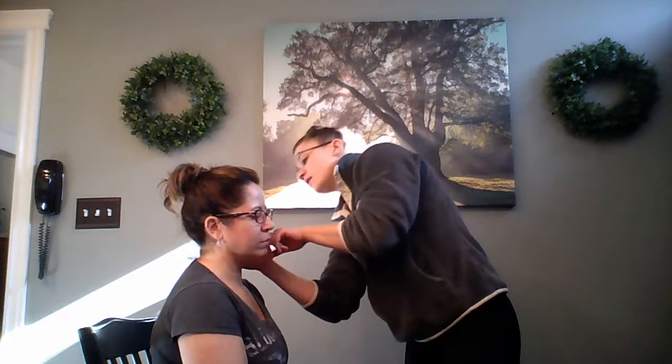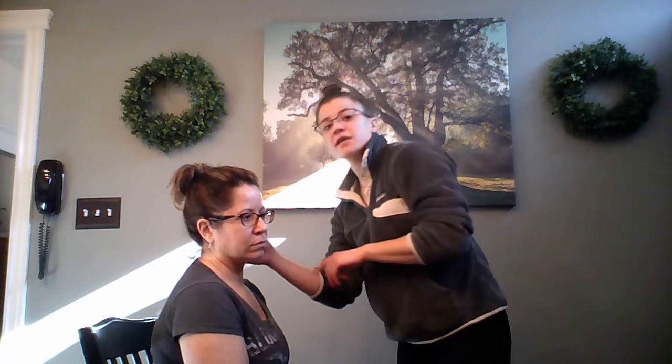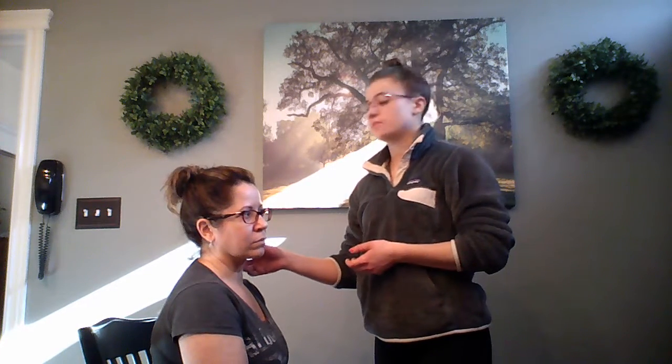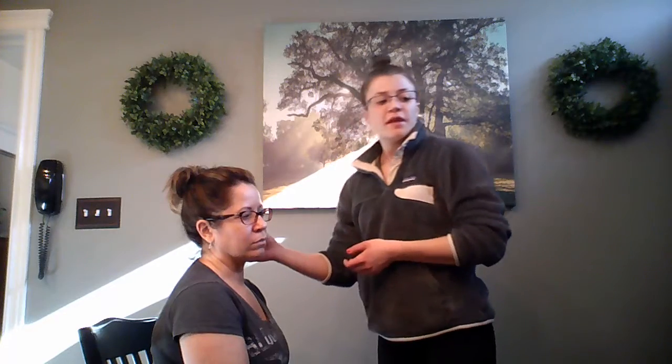Next, I would note the external auditory meatus, looking for swelling, discharge, or redness; there's none present at this time. I would then take my otoscope and position to see the eardrum, noting any redness, swelling, lesions, or foreign bodies in the ear. Then I would inspect the tympanic membrane, noting the color and characteristics. The normal eardrum should be shiny and translucent.